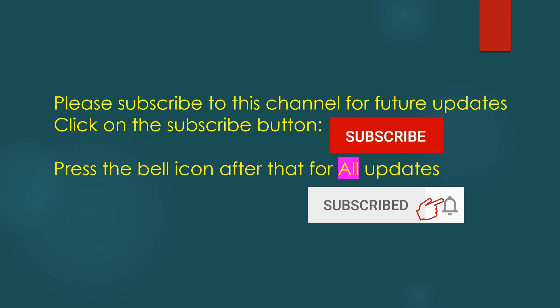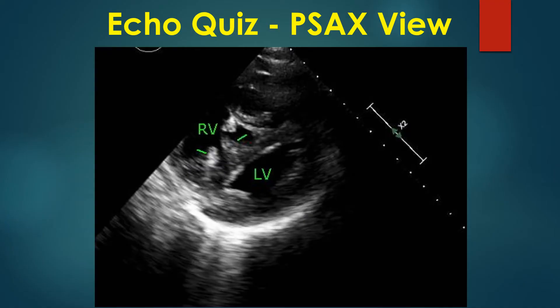ECHO from parasternal short axis view shows a D-shaped left ventricular cavity alongside a grossly hypertrophied right ventricle.